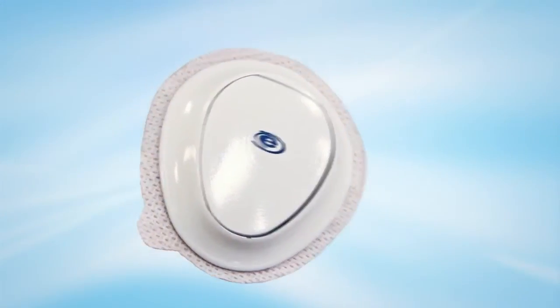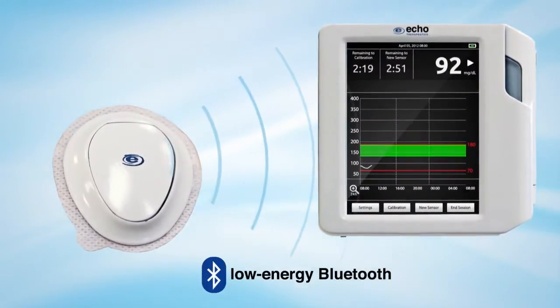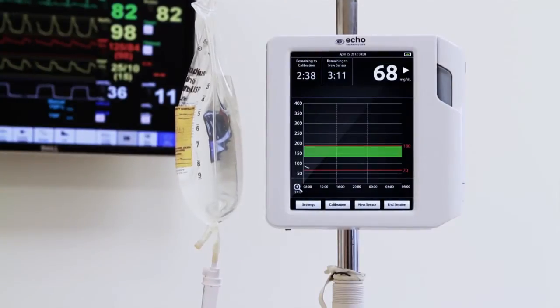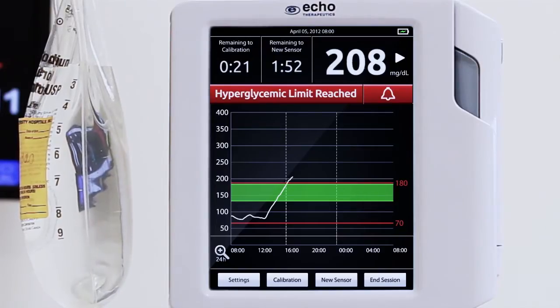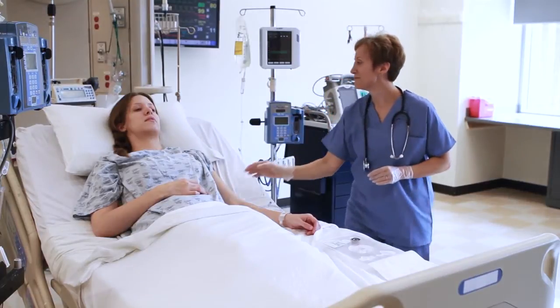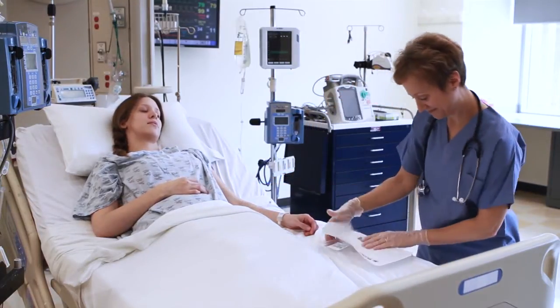Symfony begins transmitting and displaying glucose data every minute after a brief 60-minute warm-up period. The pole-mounted monitor displays and stores the glucose information and produces visual and audible alarms that can be customized to meet an individual patient's target ranges throughout their stay.